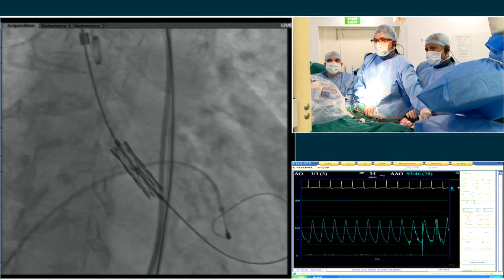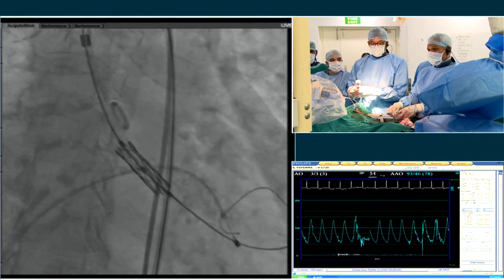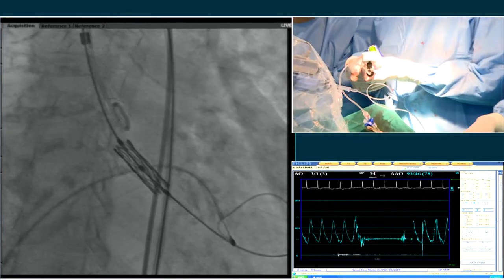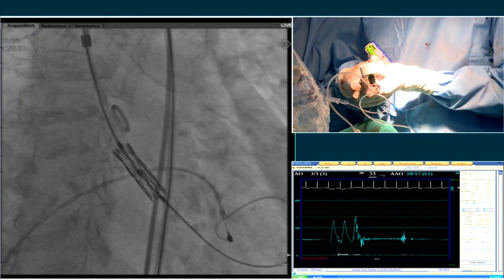So we'll do a 10 for 15 for this next injection. And this will be under pacing and then on fluoro. So we'll do a store fluoro because I don't want the Cine to cut out. You're ready? Okay. Who's going to do pacing? Ready? Okay. Perfect. You ready? Everyone good? Okay. Pacer on 180.